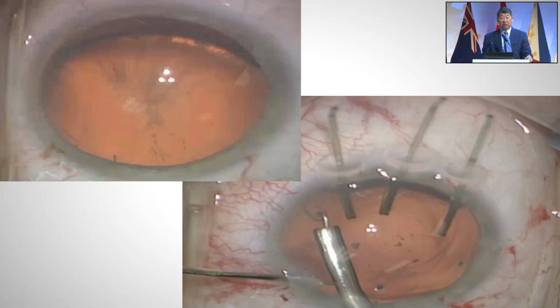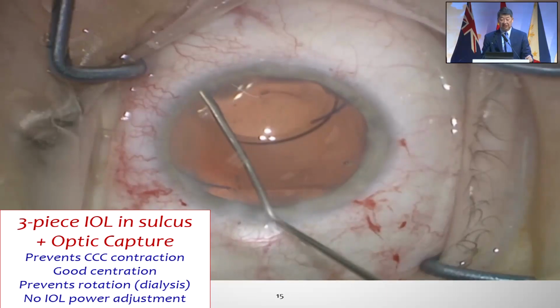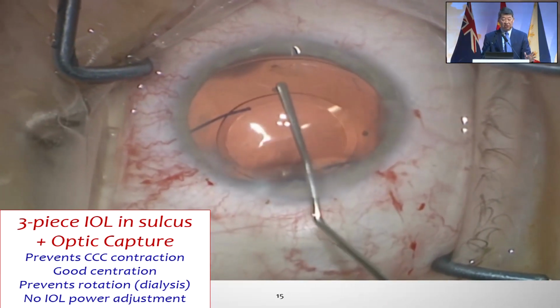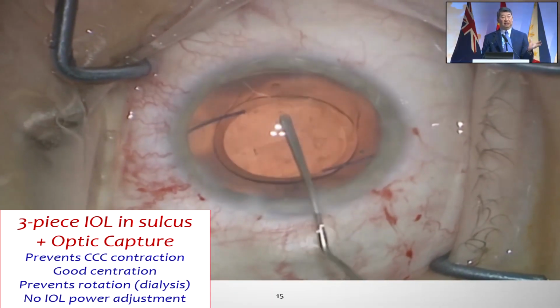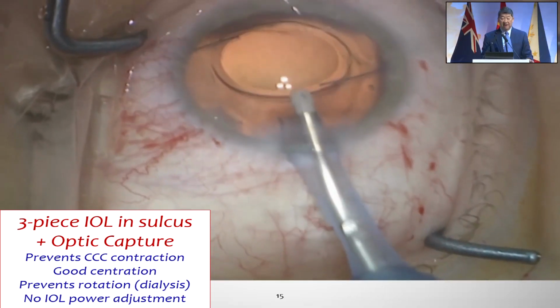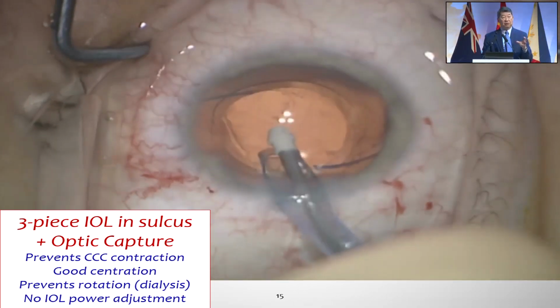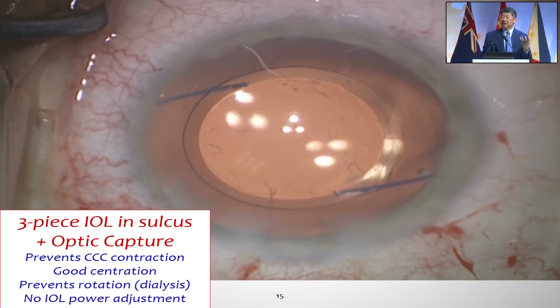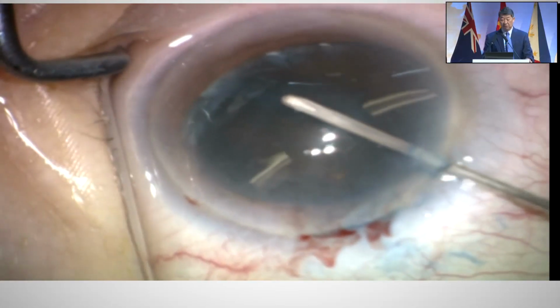Now here's a case with a zonular dialysis nasally. I've got my retractors in, and so I'm going to do the same thing. Now here I'm going to put this in the sulcus. I don't want it to rotate into the meridian where the zonular dialysis is, and I'm going to capture the optic. Before I do, I aspirate some of the viscoelastic behind the IOL, because remember, we're trapping the optic in the anterior capsule, and this prevents contraction of the rexis, it centers the lens, prevents rotation, and I don't have to adjust the IOL power.